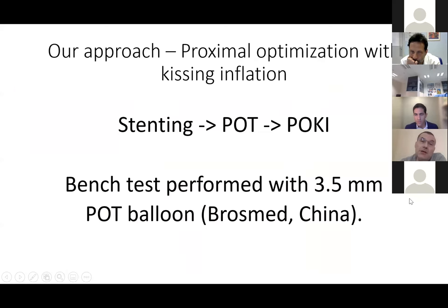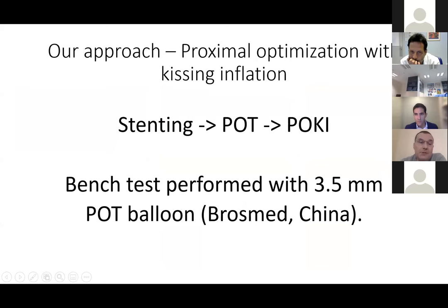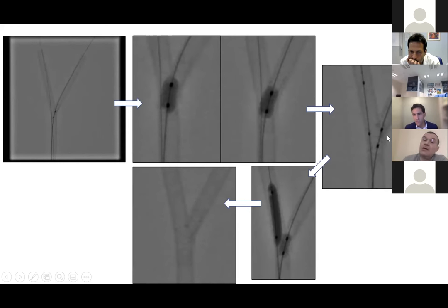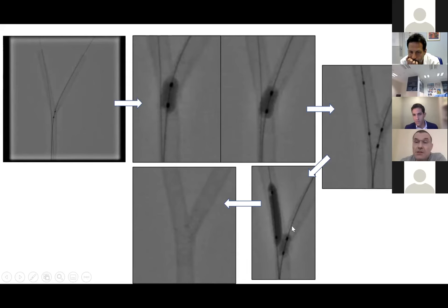So we proposed an alternative technique: stenting, POT, and POT with kissing inflation done simultaneously. The next tests were performed with the Brosmet balloon for POT. The same stent was implanted, then we made a POT — this is the first POT — and then we made the POT with kissing inflation. We just kept the balloon at the same place, and after the wire crossings, we made the inflation with a specific way.